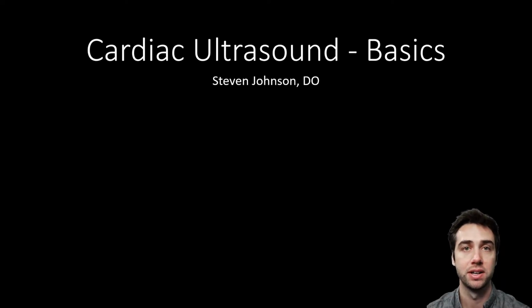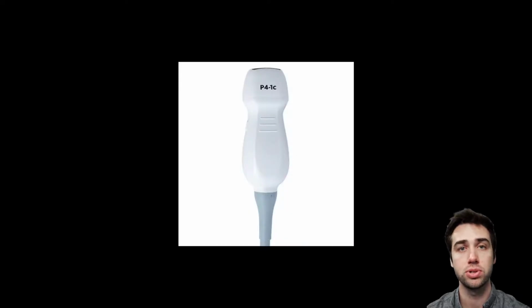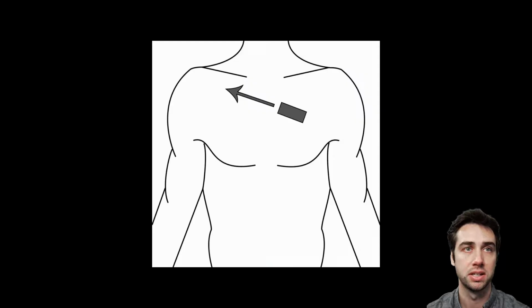My name's Steven. First thing is probe selection. The majority of cardiac ultrasounds we're going to be using the phased array probe. This is what it looks like. The first view we're going to be getting is something called the parasternal long axis view.